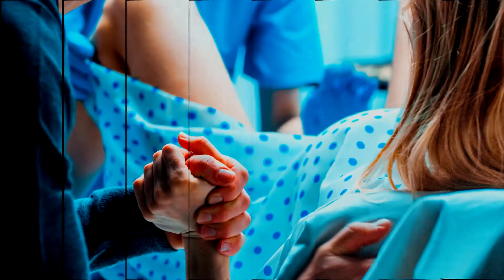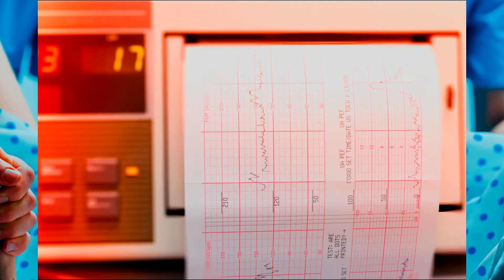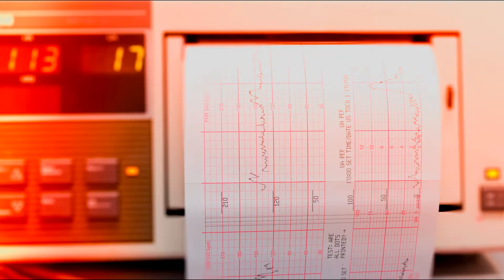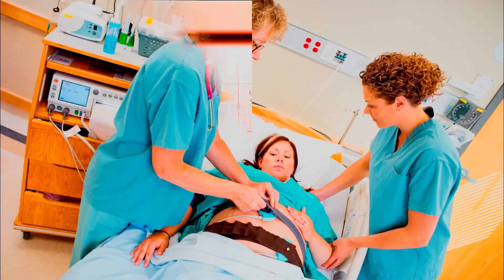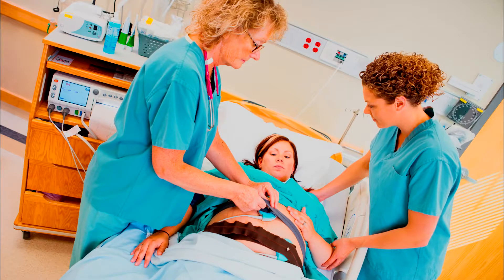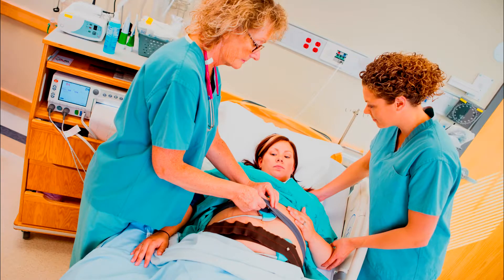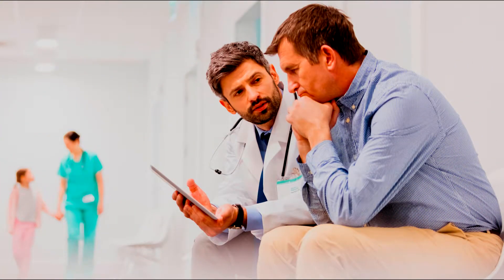In today's talk we will discuss understanding fetal bradycardia and HIE in the context of labor and delivery. Fetal bradycardia, for our discussion, is when the baby's heart rate baseline falls below 110 beats per minute. It is important for doctors and nurses to understand this condition, especially if there are other signs of concern present during labor and delivery. Fetal bradycardia can be displayed on the electronic fetal heart monitor, and can be present alone or with non-reassuring findings.